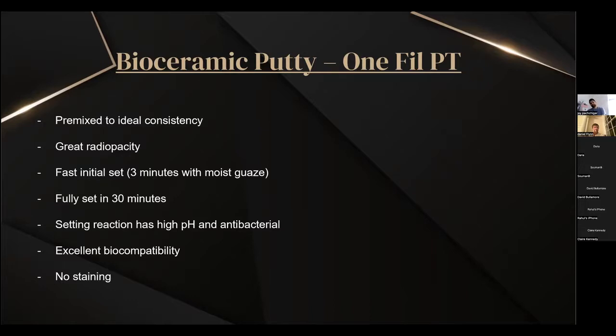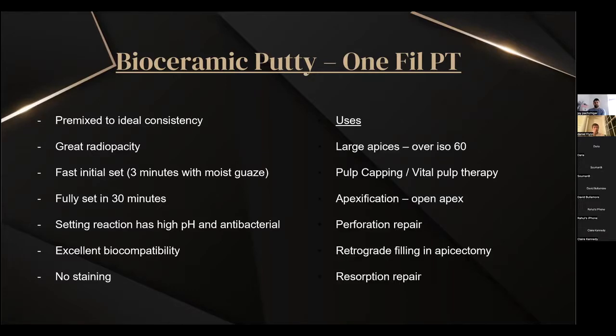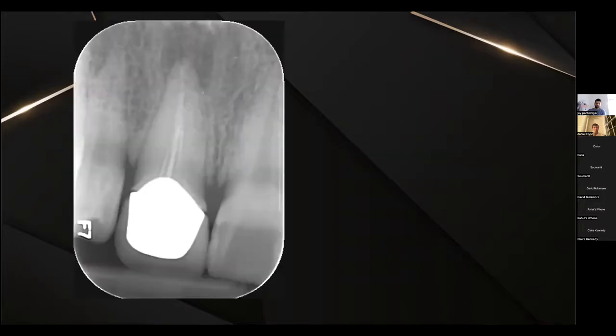And again, with the bioceramics, there's no staining. So these can be used in anterior teeth without concern for staining. So where I probably use these type of materials the most is in the large apices. Anything over 60, I will go with a putty. But again, it's got a number of applications, as you can see here. So again, just a few cases that I've used this on.